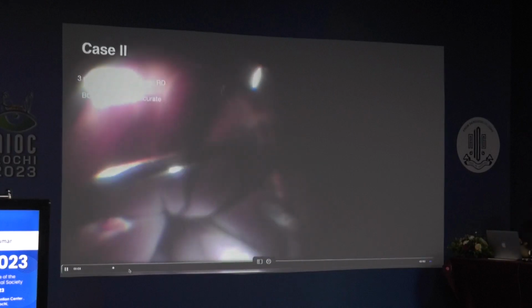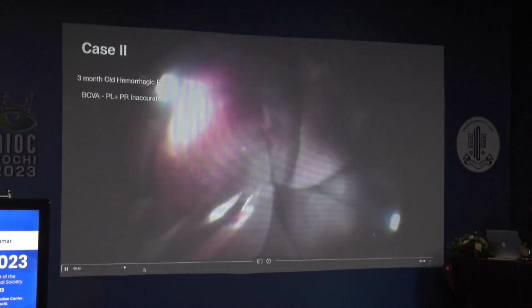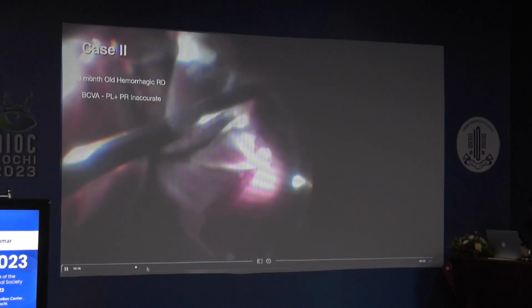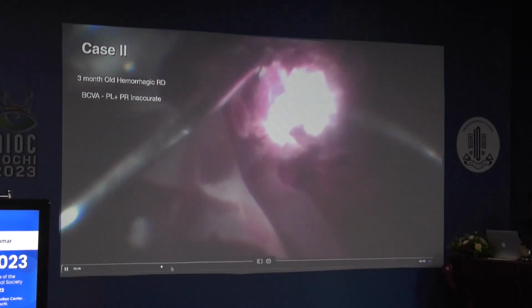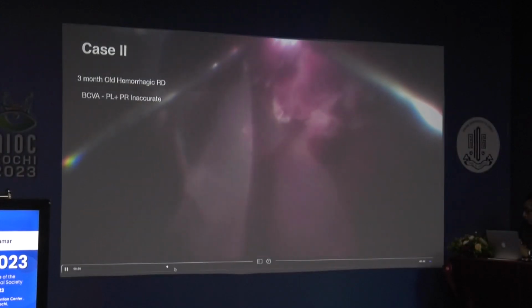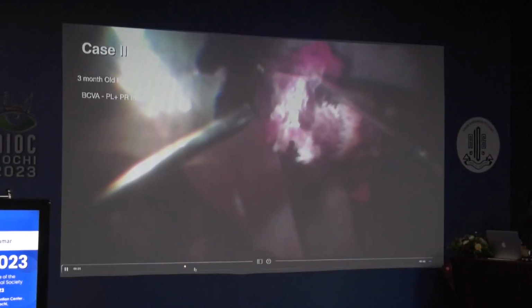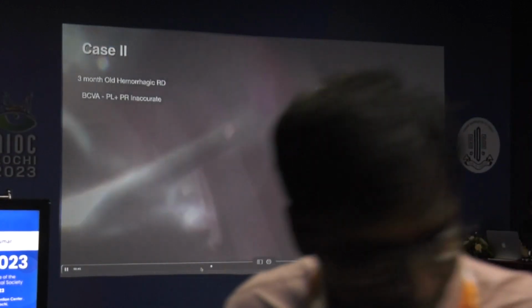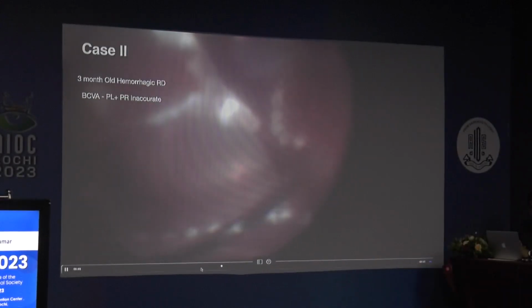It is so extensive that the RPE must be totally compromised, where you have to replace it with a subretinal RPE choroid patch graft transplantation. The blood was almost clotted, and it was very difficult to remove the blood as well as the subretinal CNVM part. Practically, the most difficult part is the CNVM part because it couldn't be removed.